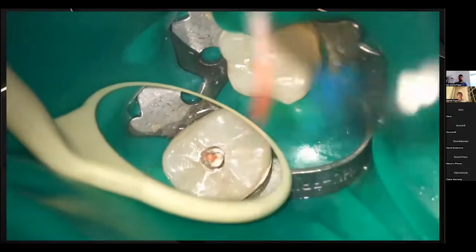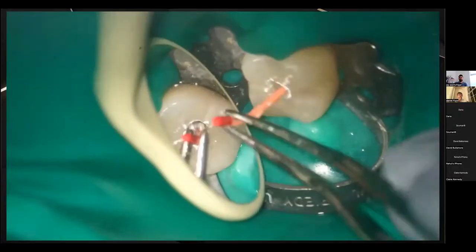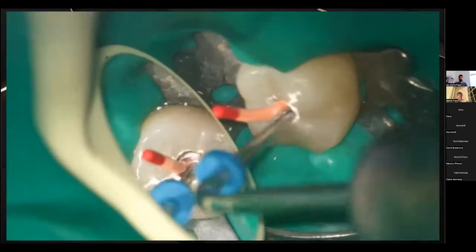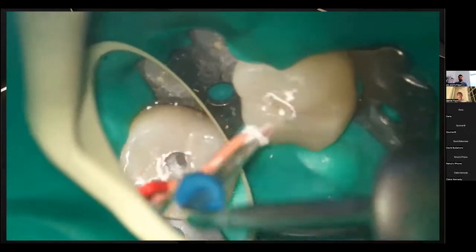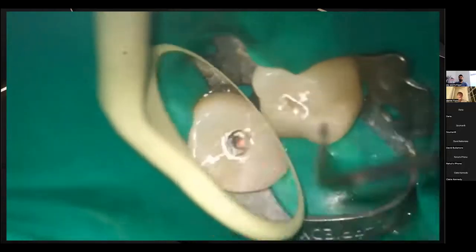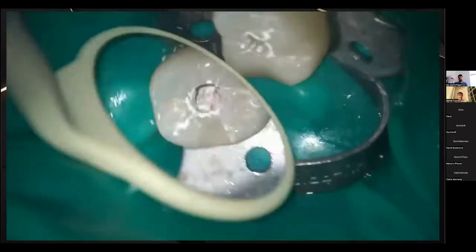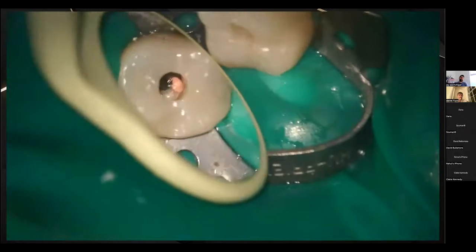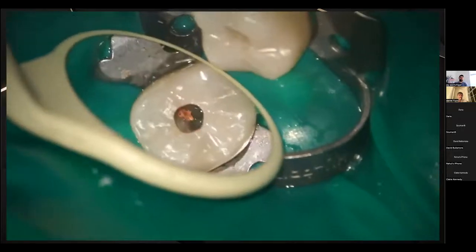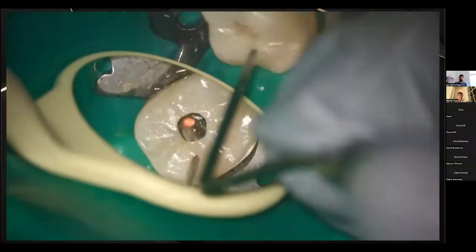And with the distal, I actually do a little bit of down pack over here. So I'm really trying to get that sealer in because it wasn't patent. You know, probably about 5 mils down pack into that canal. Really trying to get that sealer in, and a bit of backfill here as well. And again, with the cleanup, sometimes you do just nick that GP there. And again, it's very easy to just condense that back into place.